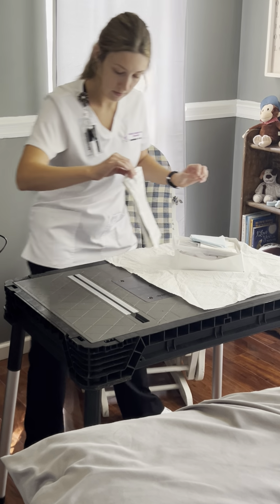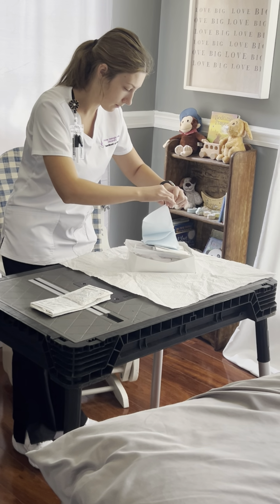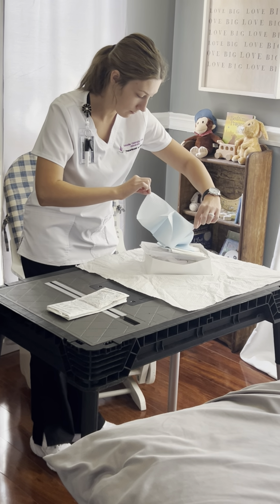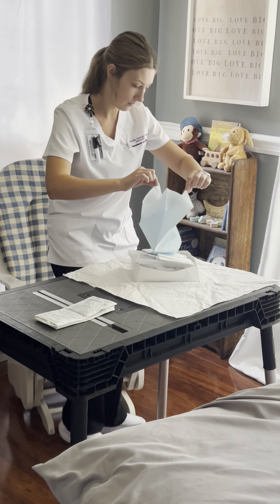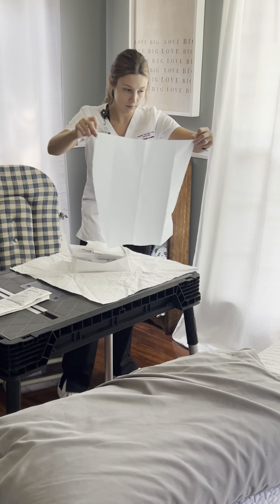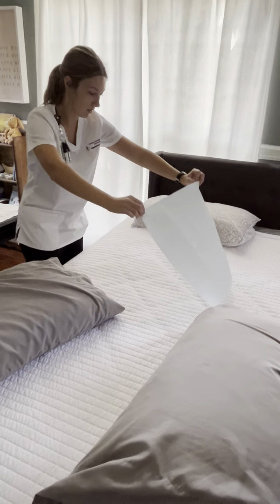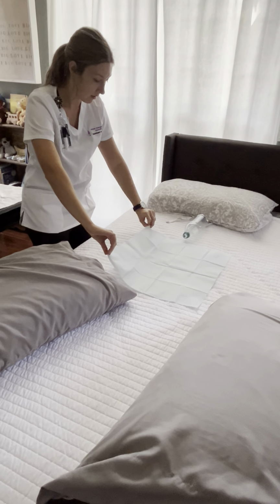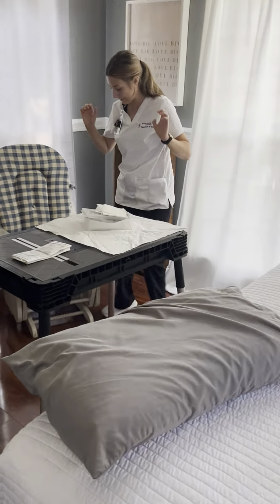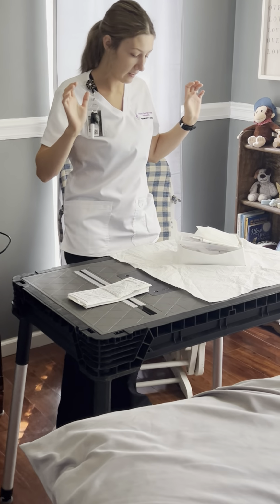I'm going to grab my drape. I'm going to come over here and do shiny side down for my patient. Shiny side down. Perfect. Come over here, keeping my hands above my waist.